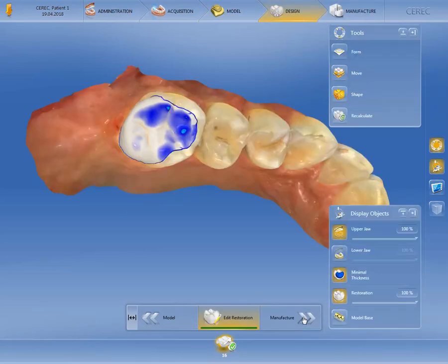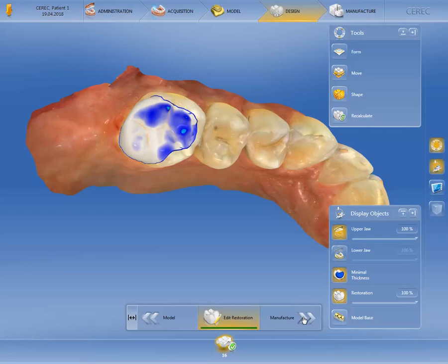Based on the biogeneric and with consideration to the parameter settings, the CEREC software has now calculated an initial design proposal. In the design phase, you also have access to all functions in the side palette. As the initial proposal design meets our expectations and there is no need to adjust contact areas to the antagonists or adjacent teeth, we can switch directly to the last phase, the manufacture phase.